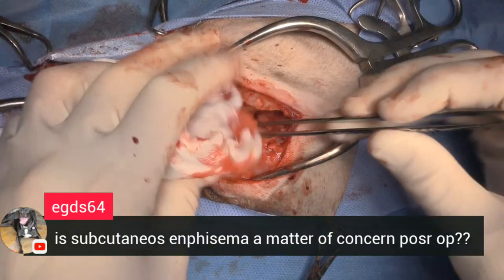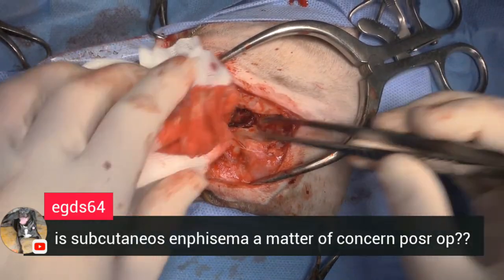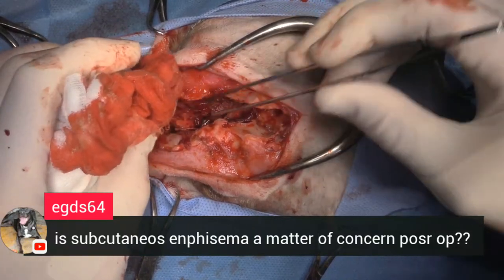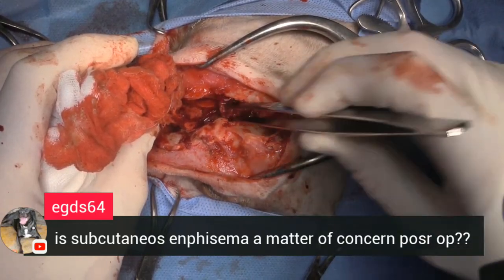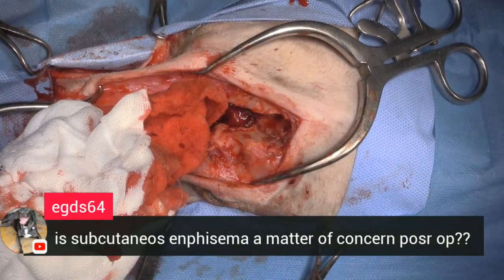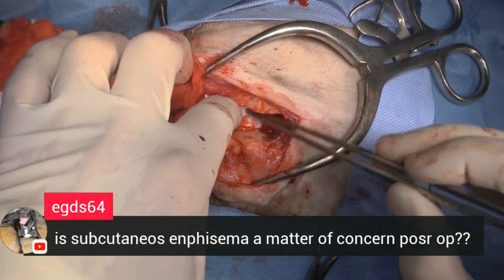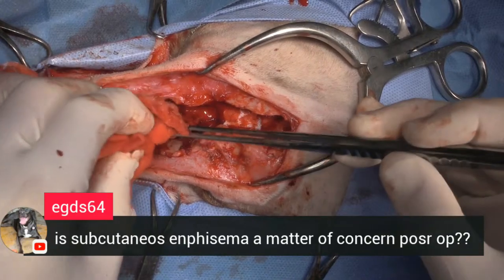All right, so now we'll come out with our sponge. I come out slowly, so if there's bleeding, I can address it as we go instead of trying to work in a puddle of blood. There's a little bit of bleeding right there, so I'll just put a little piece of gel foam on it. There's a comment that they prefer surgeries with less blood, so do I. Not my favorite surgery.